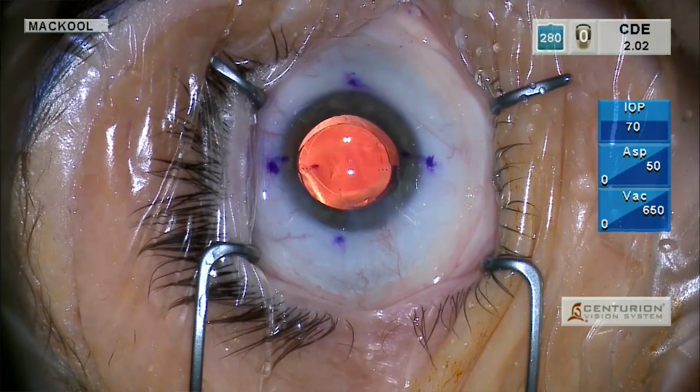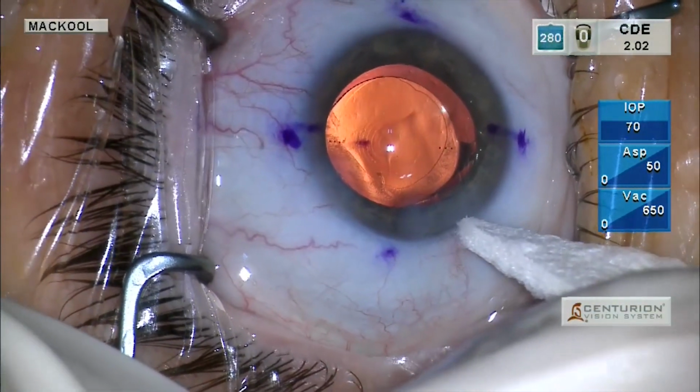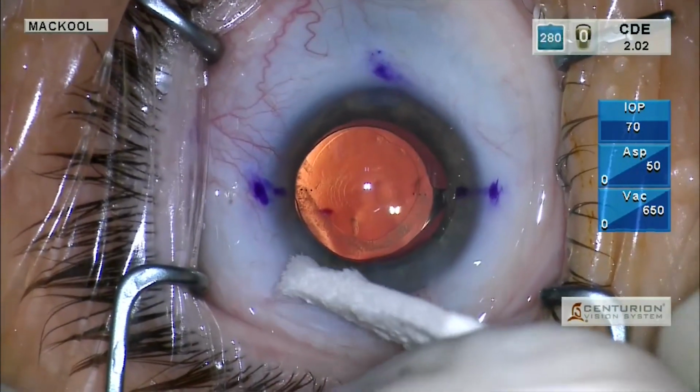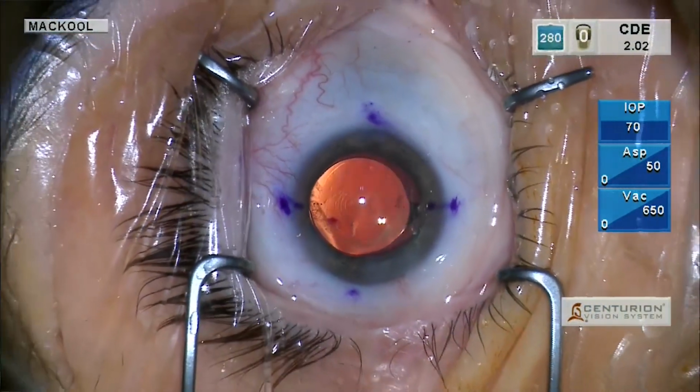And then, especially early experience, you'll test your incisions and make sure that they're not leaking. And you can see how dry that one is. And you'll do the same on the side port, and that's dry also. So the procedure is now completed.